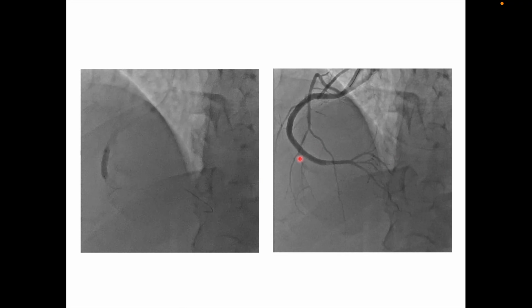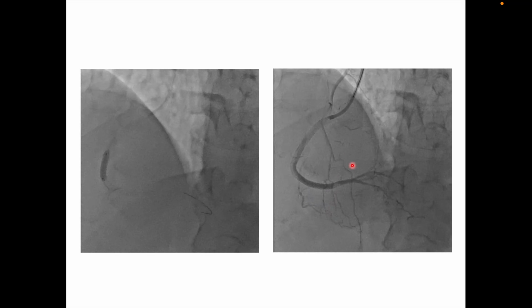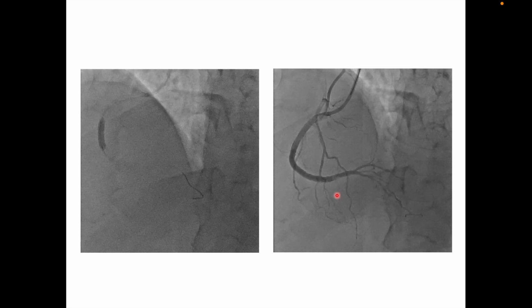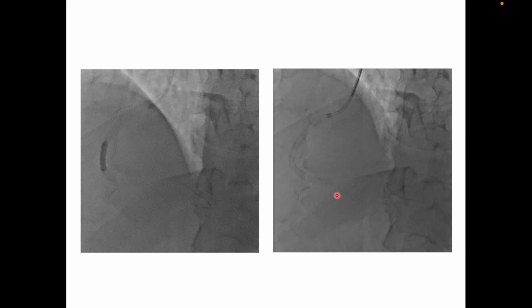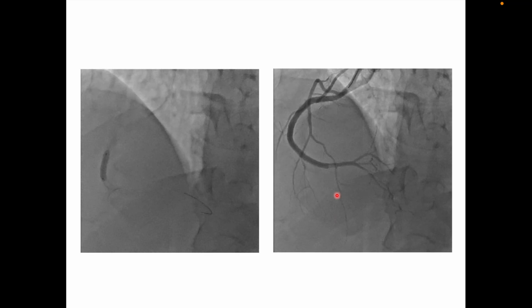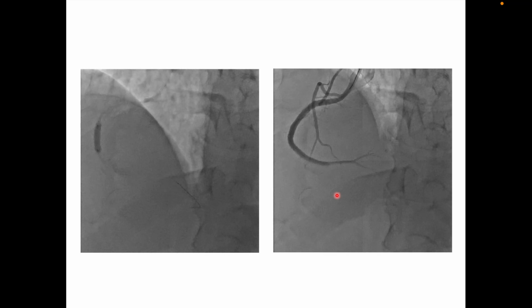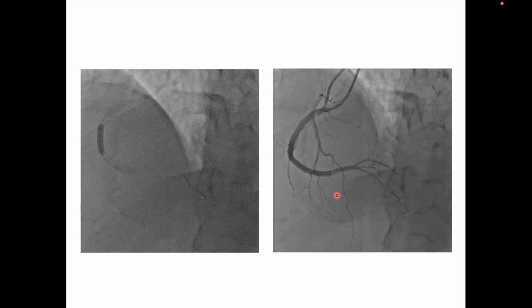distal haziness that you see here, which one would be very uncomfortable leaving at the stent outflow, but since we've done the IVUS, we are comfortable that there is no stent edge dissection, it's just thrombus hanging there. So we kept the patient on 12 hours agrastat, and the patient was discharged.